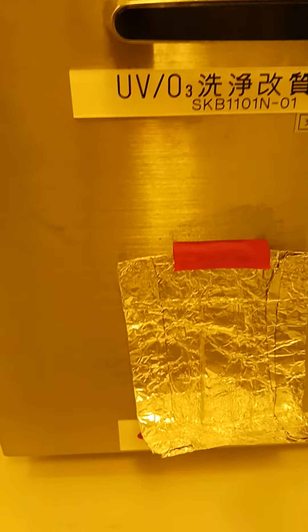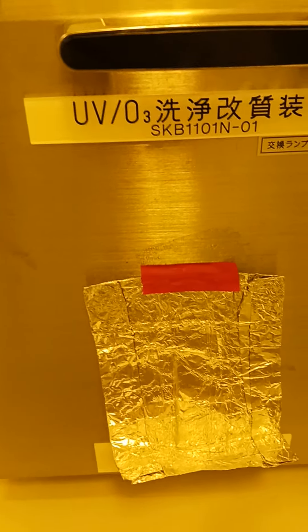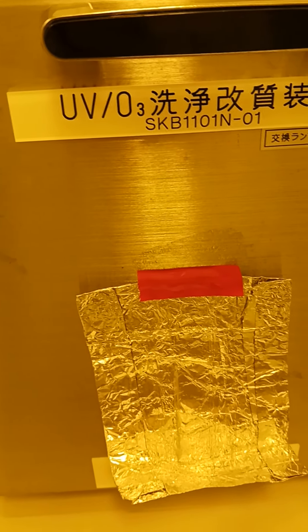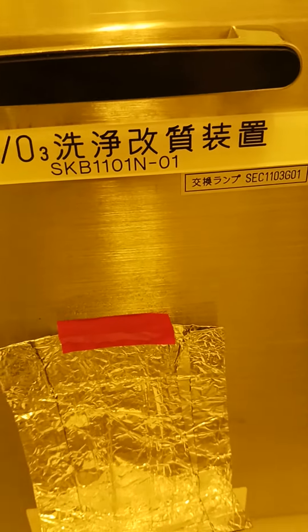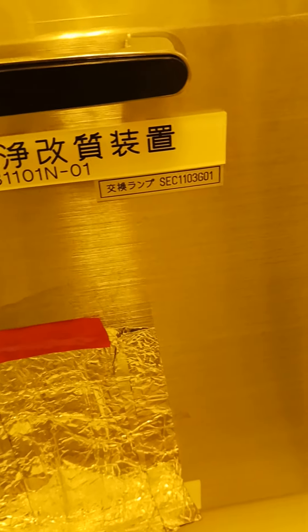Hello everyone, hope you are doing well. Today I will show you the ozone machine, or UV machine. You can see the ozone or UV — if you need ozone ray or UV ray, you can use this machine easily.